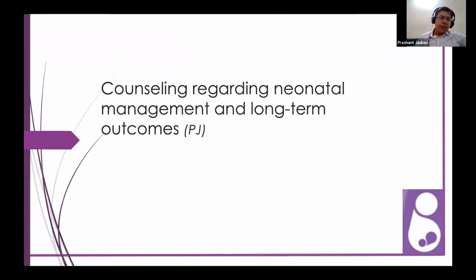For a 100% accurate diagnosis, you can do it only once the newborn is there, within the first 3 weeks if you are able to get it done. Later on, it is not routinely recommended. If you already have some antenatal signs on the ultrasound, then maybe you will have to repeat it. Proving a positive IgG is less important. It is more important to repeat the postnatal imaging and see whether the findings detected prenatally have persisted, regressed, or increased. The postnatal imaging would actually decide the outcome.